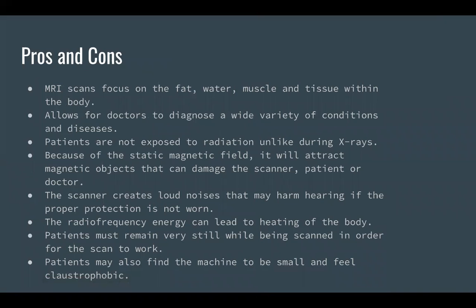Overall, the MRI is a very beneficial invention with the proper precautions with scanning a patient. The MRI allows doctors to gain a better understanding of the body because of the detailed images, as well as allowing better care for patients. This advanced technology allows for diagnoses of conditions and diseases that cannot be seen from the skin, and without the use of MRI may never be found.